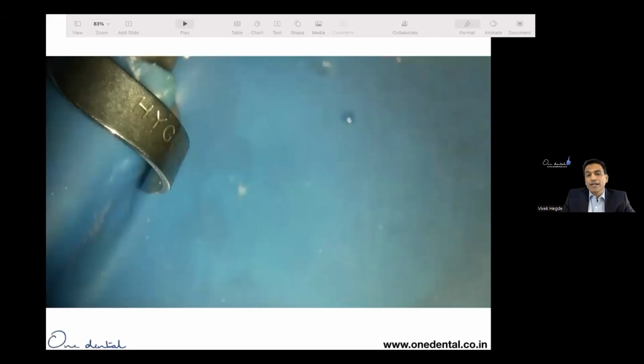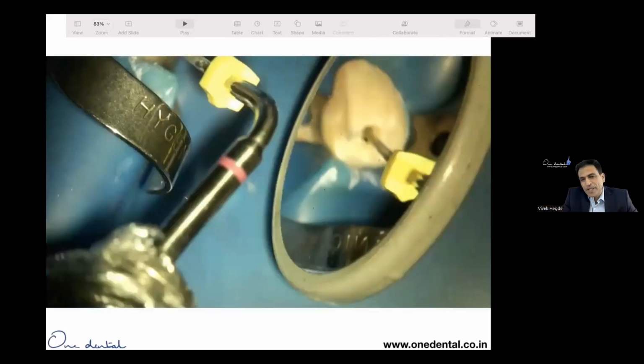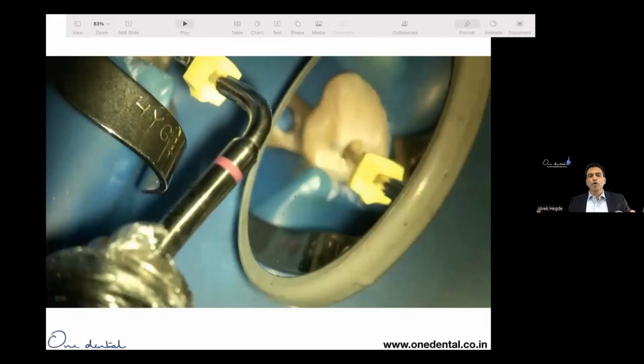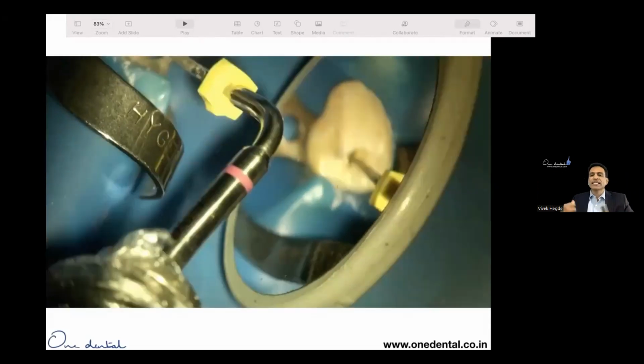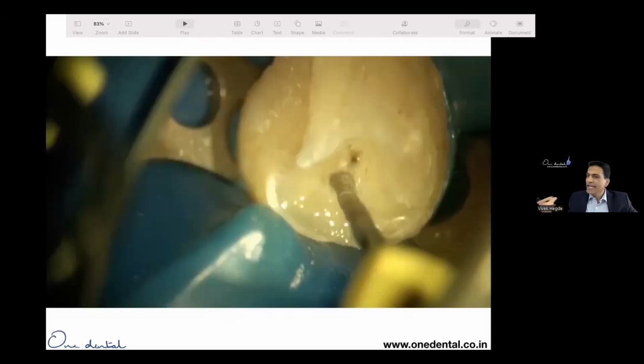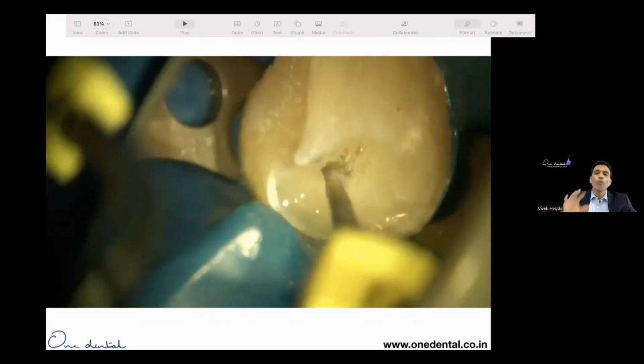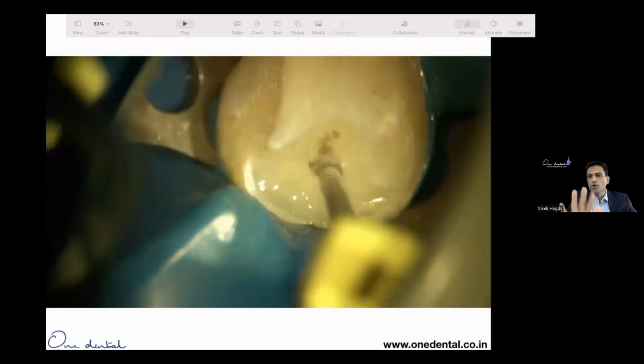And then here, this has got importance because somebody said earlier that heated hypochlorite is better. So we used to heat with baby bottle warmers, beakers, preloaded syringes, and take it into the system. When you take that, what happens? There's a loss of energy. The heat is gone. It's a proven fact that heated hypochlorite works the best in the root canal system.